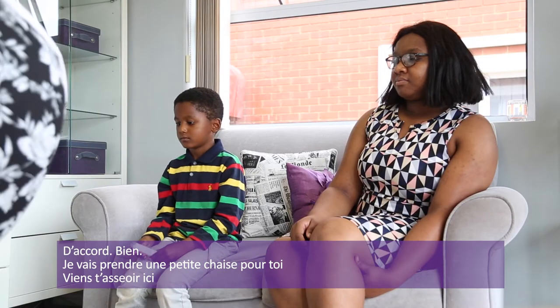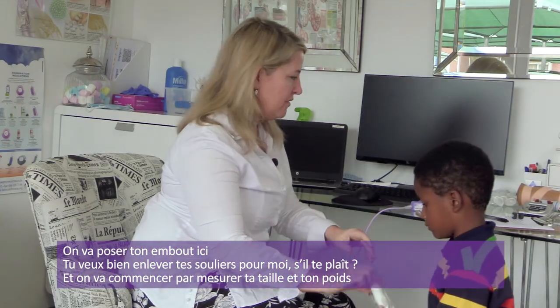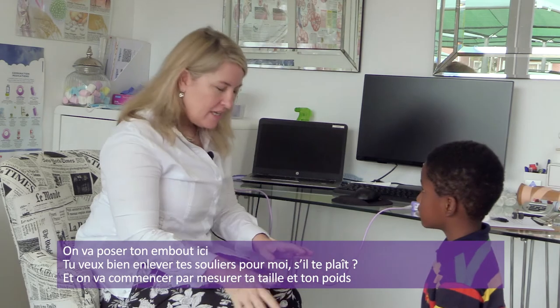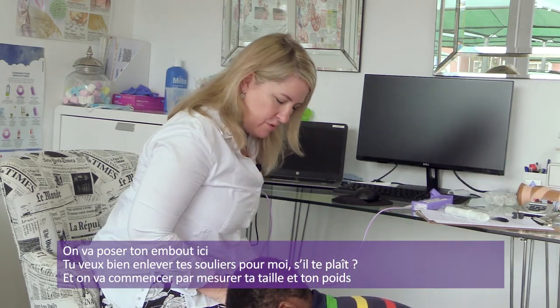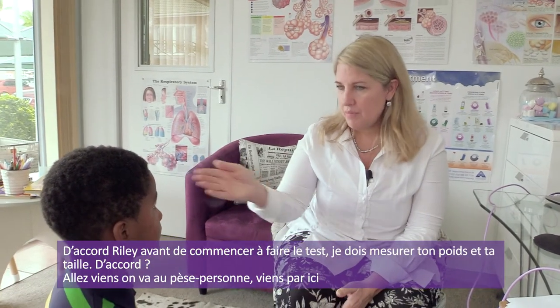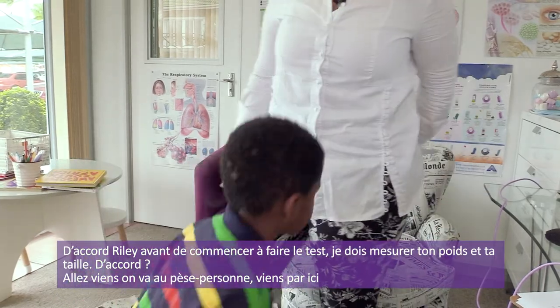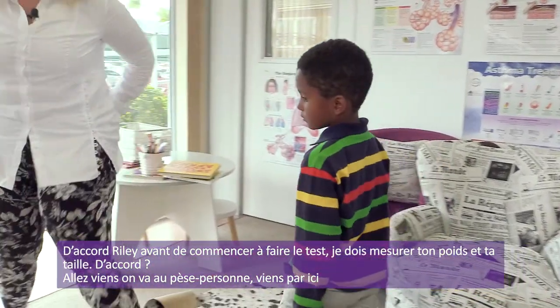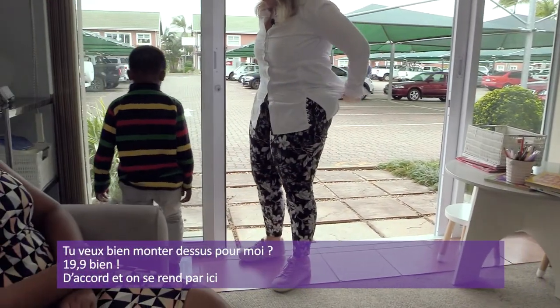Okay, so let's get you a little chair. Okay, you can come and take a seat over here for a moment. Okay, you can put your mouthpiece down over here. Do you mind just taking your shoes off for me, please? And we're going to take your height and weight first. All right, so Riley, before we start doing the test, I just need to measure your weight and your height. Okay, so come, let's go to the scale. Come this side. All right, do you mind just getting onto the scale for me?